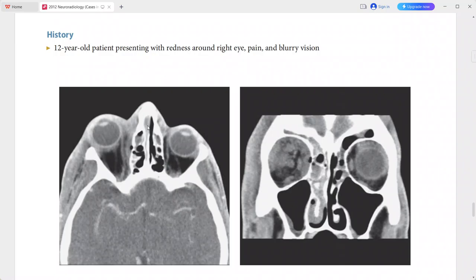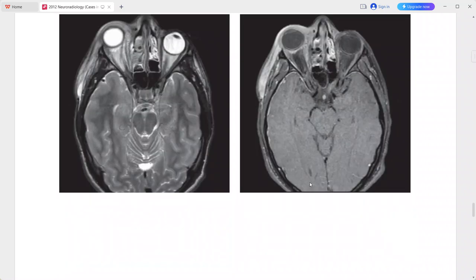The ethmoid sinus and frontal sinus are opacified. On axial T2-weighted MRI, the rim-enhancing collection shows hyperintense material consistent with fluid. There is also proptosis noted.